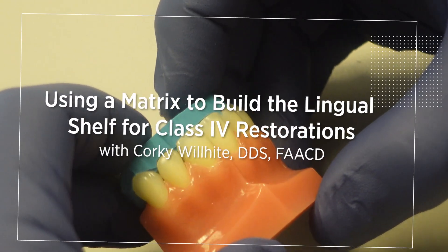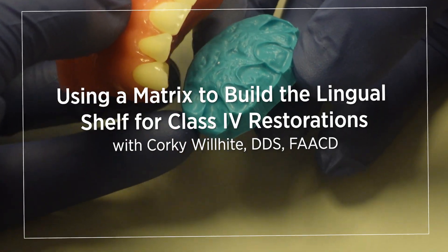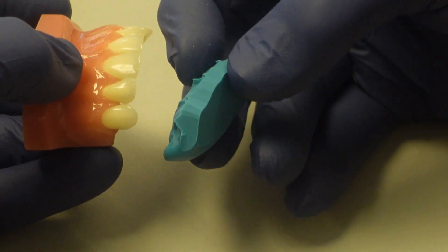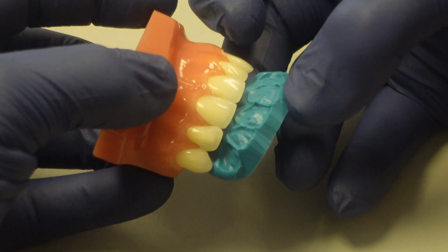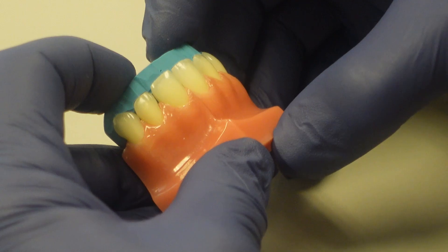Hello, I'm Dr. Corky Wilhite, and I'm going to take a minute to show you today about using a template. A lot of people call it a putty index or a matrix to build the lingual shelf. I call it the lingual layer.